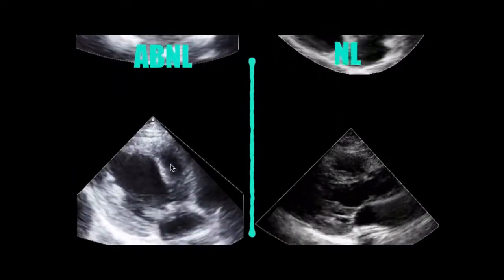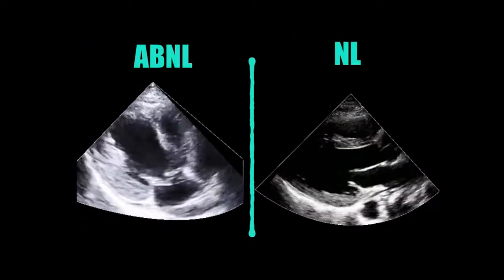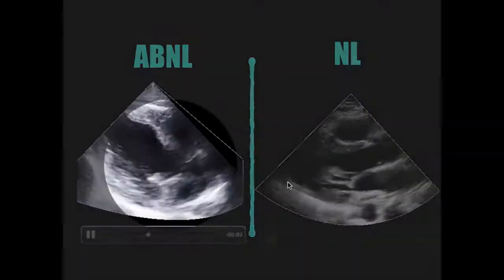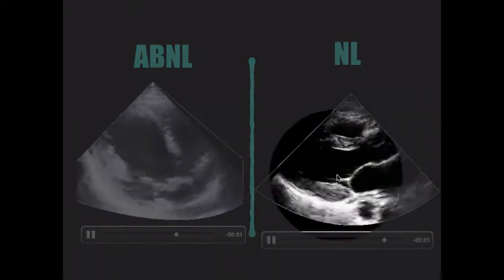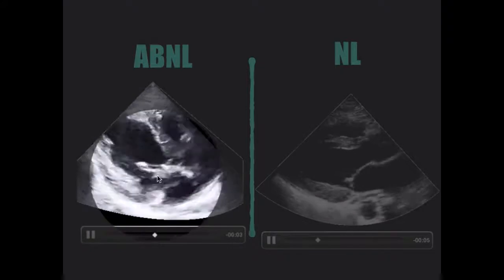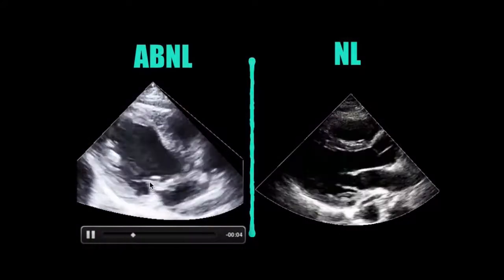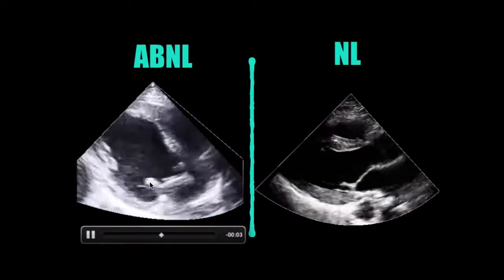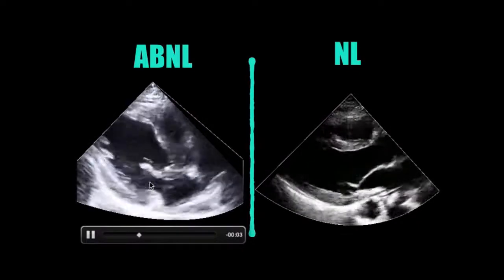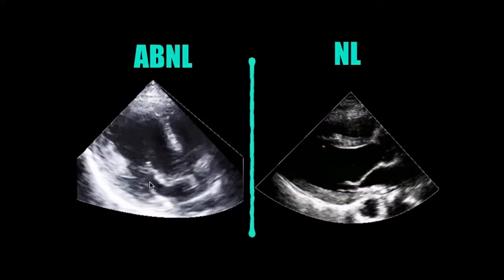This is a parasternal long axis view of that same patient that had mitral endocarditis. This is a normal mitral valve. This is an abnormal mitral valve — see how there's a bunch of goo on it? That's what endocarditis looks like. It's not that complicated: if you see a thickened, gooey, mobile mass on one of the valves, it's usually going to be endocarditis.